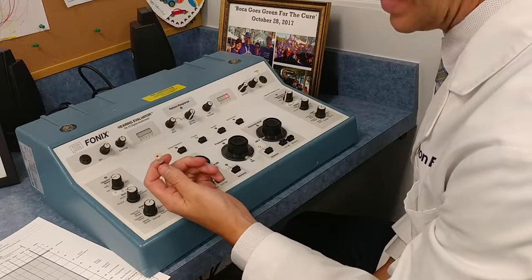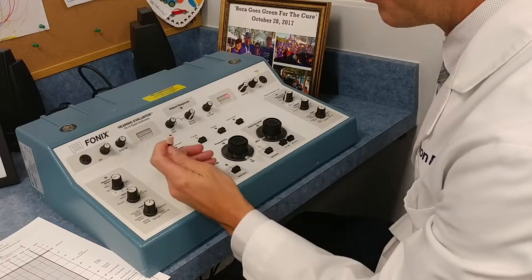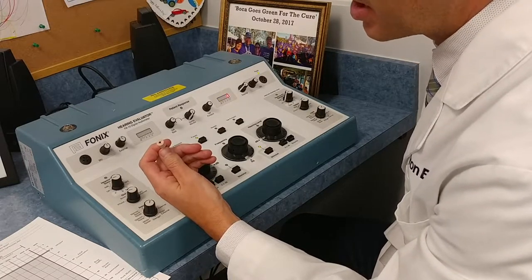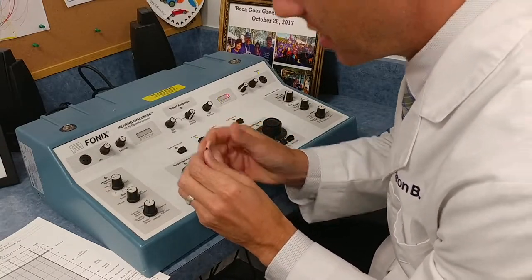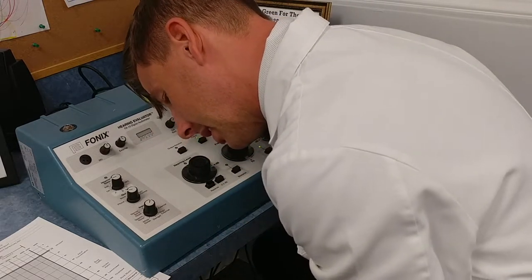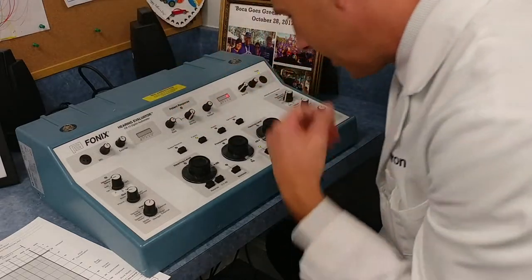I'll be utilizing inserts. With inserts, I don't need to mask as often because of the large interaural attenuation gap, and they also give me better test-retest reliability. If anybody has collapsing canals, I can do a lot better with inserts. I like the smaller ones because I want to make sure it's all the way into the canal — so when it expands, the only thing I'm basically seeing is the black part. I don't see a lot of the foam tip, and now I know that I have a good seal to get an accurate test.